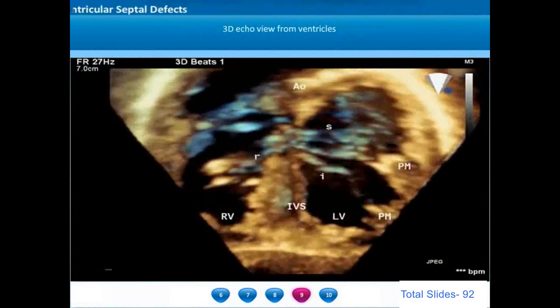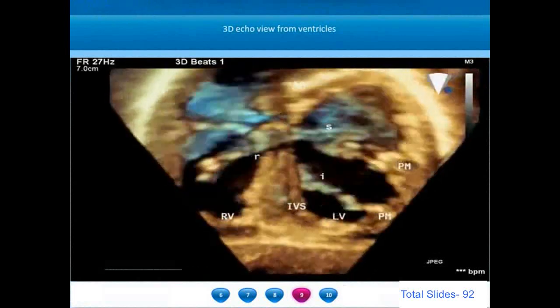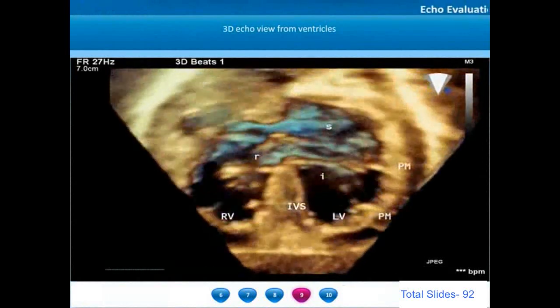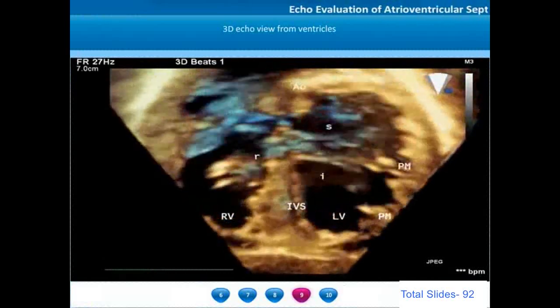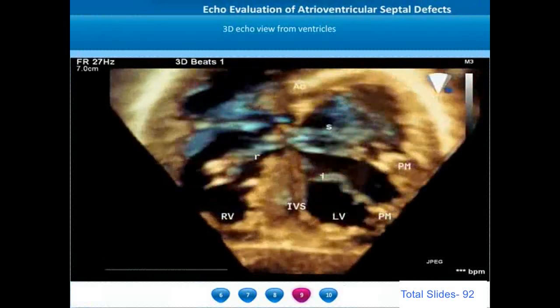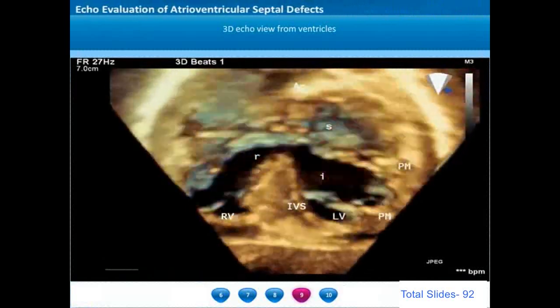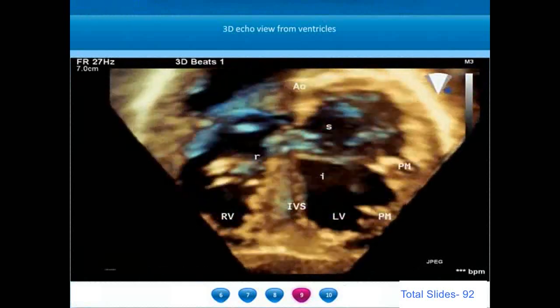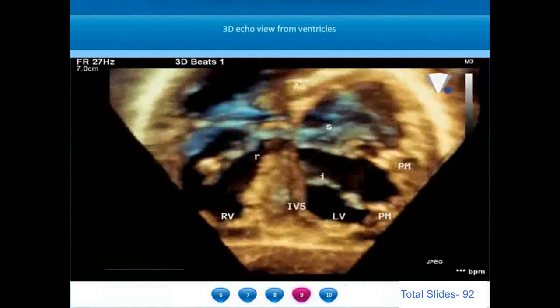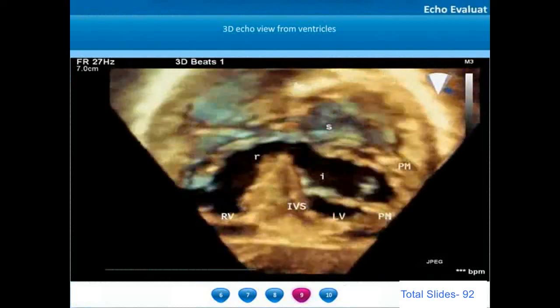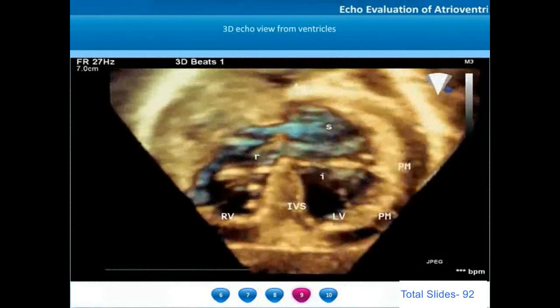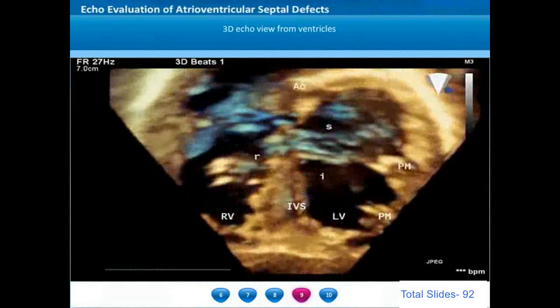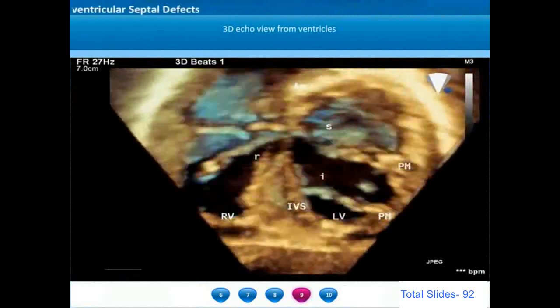On three-dimensional echocardiogram, when we move the image plane to include the mid portions of the ventricular septum, we can appreciate the two papillary muscles. Unlike in a normal heart, the two papillary muscles are counter-clockwise rotated. In a normal heart on short axis they appear at around 4 o'clock and 8 o'clock positions. Whereas in AV septal defects they are rotated counter-clockwise to around 3 o'clock and 5 o'clock locations.